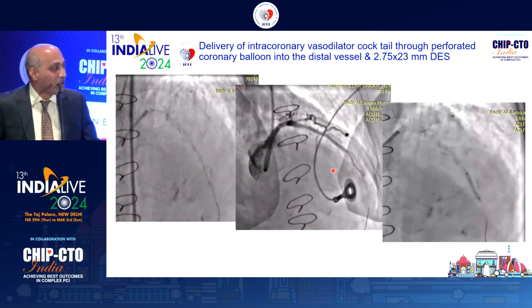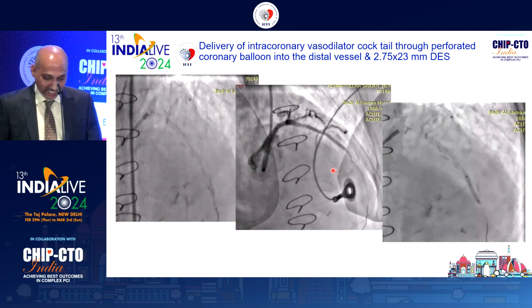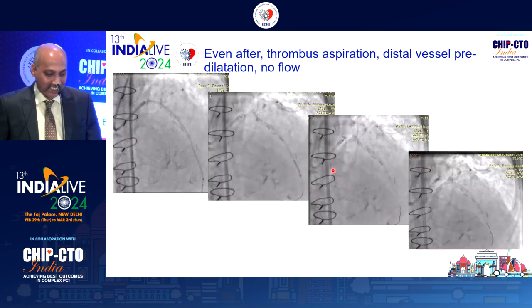That time if you put, no, TIMI one flow was there. That's why we put the No, just go back. Nothing was there. TIMI grade flow up to just distal, but beyond that, no, up to apex. That fluoro store image is not. I didn't. No, it's not there.